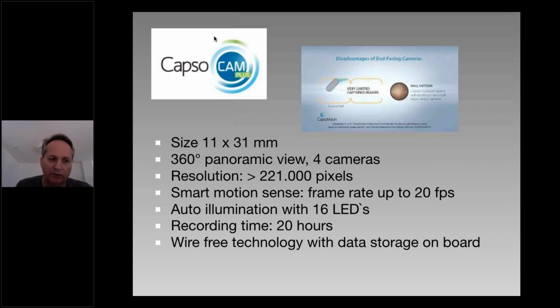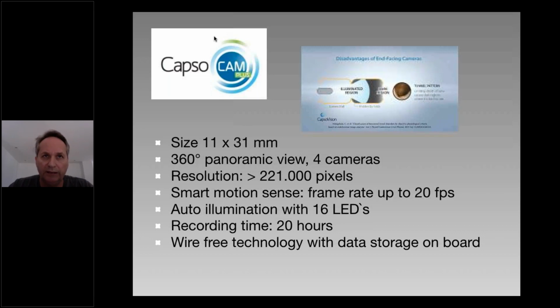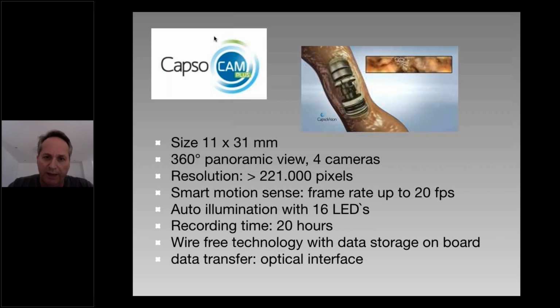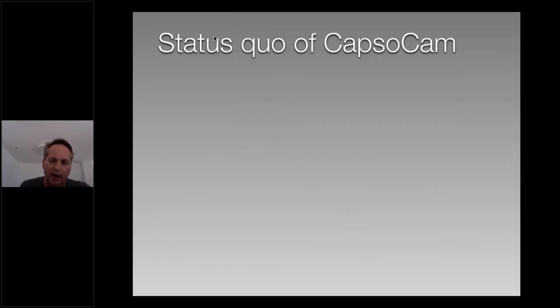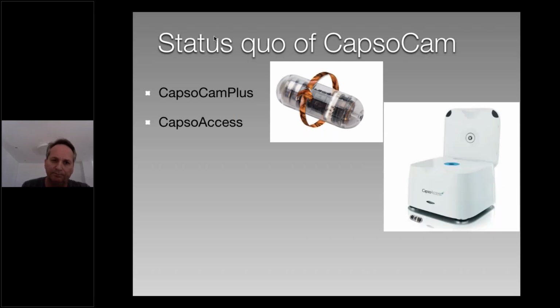It's wire-free technology, so there are no cables needed, no data recorders, all is saved on board. There's a built-in 1 gigabyte storage, and we have a data transfer and optical interface. So what we are working with is the CapsoCam Plus, the third generation of the CapsoCam.